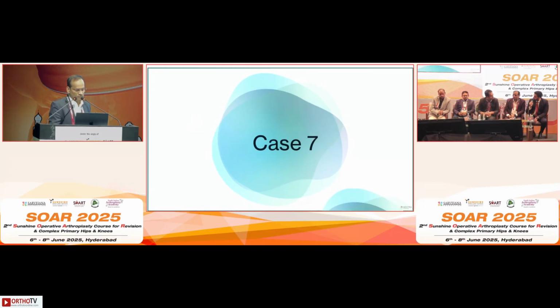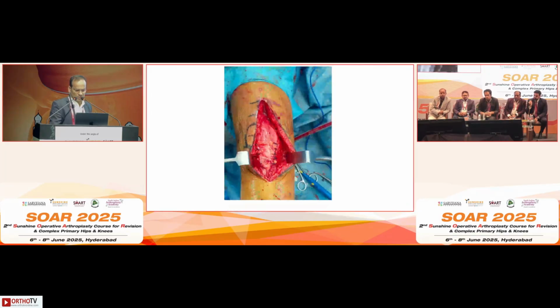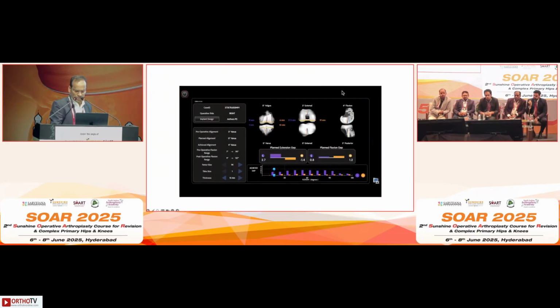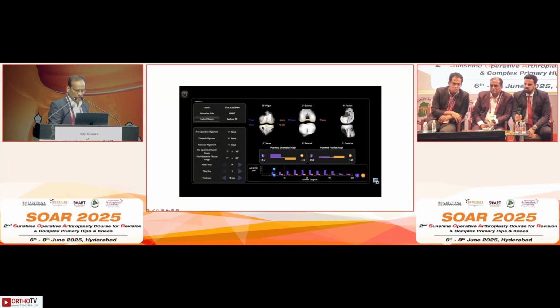How much was your distal femur cut, sir? I couldn't see it in the... Distal femur cuts, I'll just show you. It's around 6 millimeter and 11 millimeter. Okay. And still you could end up with such a high poly? Yeah. And on the tibia, just a 1 millimeter shave from the medial side. Okay, right.